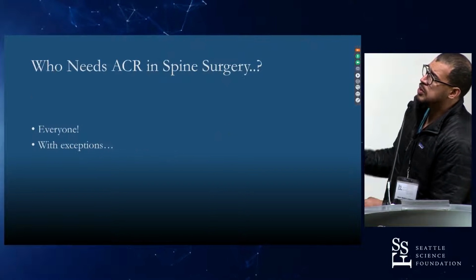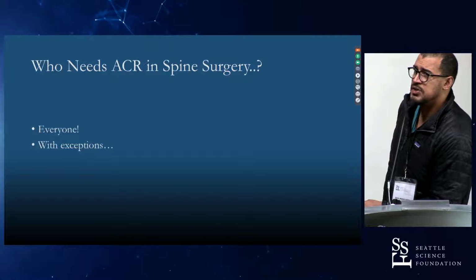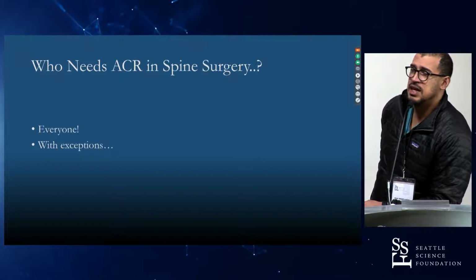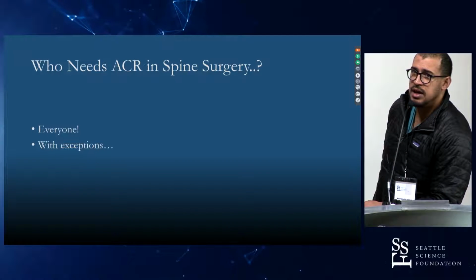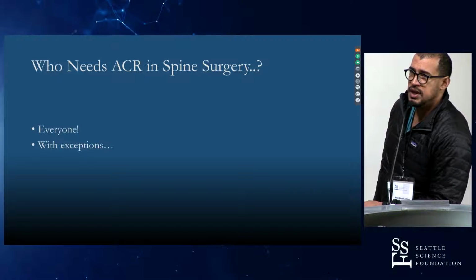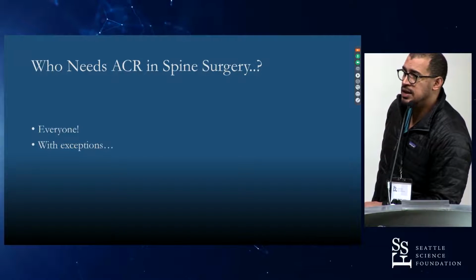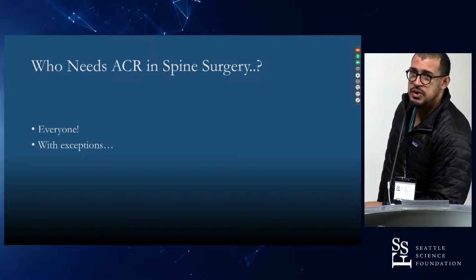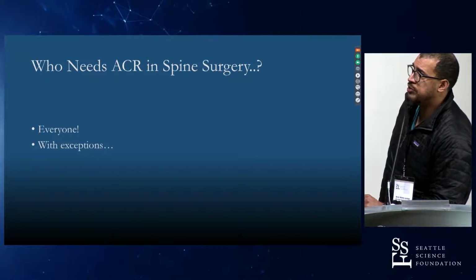And also, one of the other things that I wanted to talk about is, as we look at this, Dr. Shaffrey has looked at this pretty extensively. As we get older, we have a natural kyphosis that happens to us. And in a patient that is in their 50s and they have a PI-LL mismatch, you want to restore that back down to 0 so that it's matched pretty perfectly.